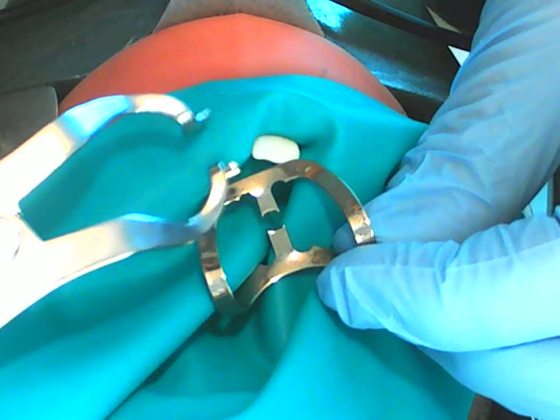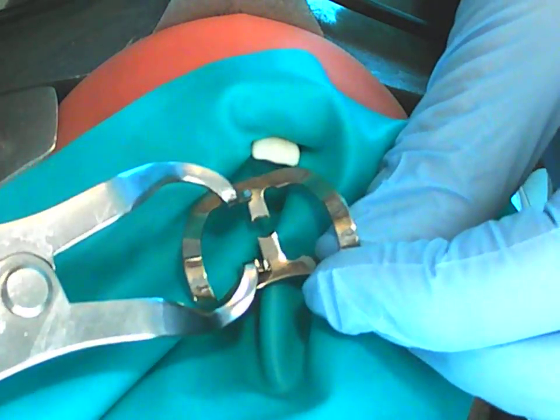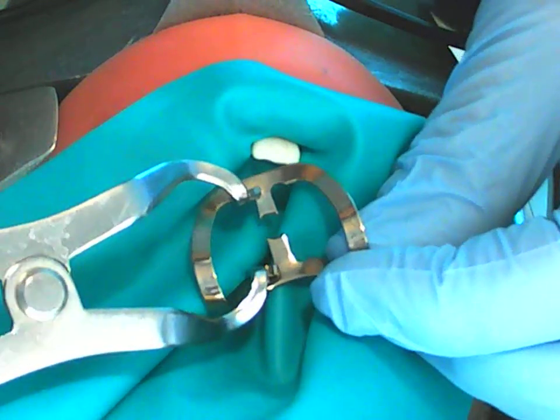Can you see that right here? And right here, the little grooves. That represents where the holes would be on all other clamps other than this one. And I'm going to wrap this safety floss to ensure stability.